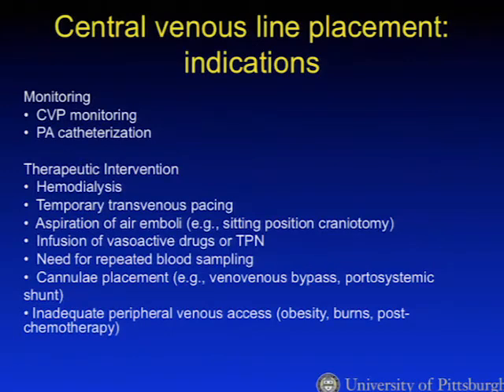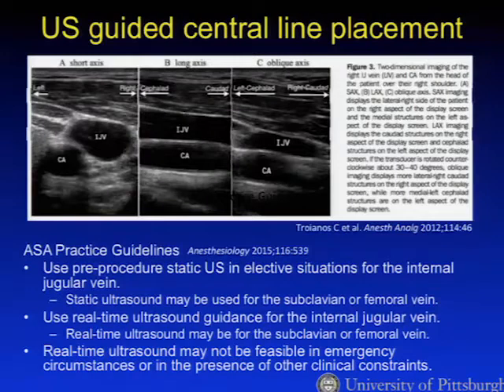Moving now to central venous catheterization. I've grouped the indications into broadly those that relate to monitoring and those that relate to therapy. Obviously, ultrasound guidance for central venous catheterization is something you're all quite familiar with, and it certainly is a favorite topic of the American Board, with sonographic anatomy of the IJ appearing on past keywords.